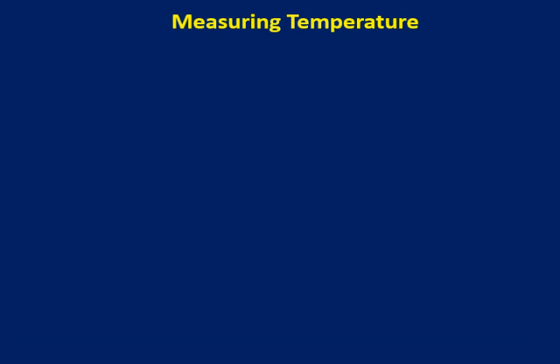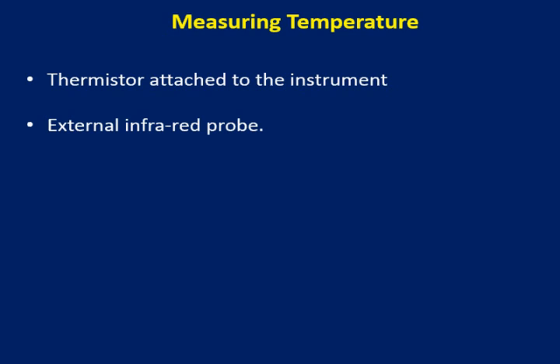The temperature can be measured using a thermistor built within the instrument or using an external device such as an infrared probe. My preference is to use an external device as it gives results instantaneously and it is far less cumbersome to use. It does not involve taping thermistor, associated wires, etc.